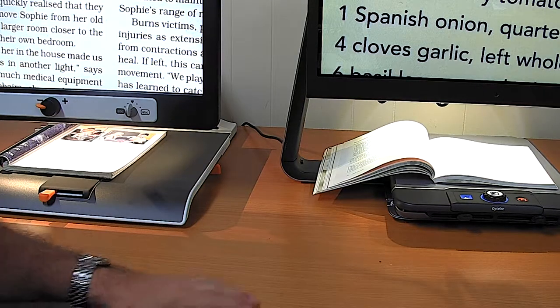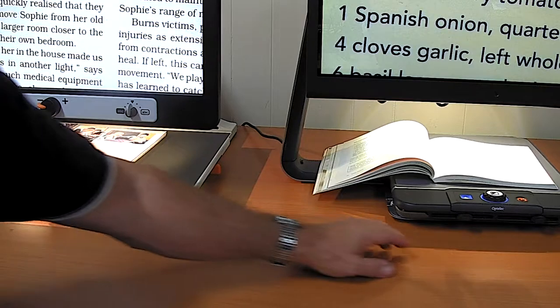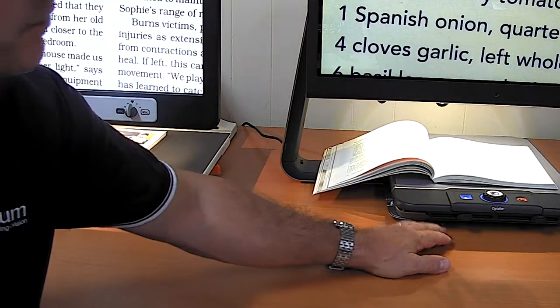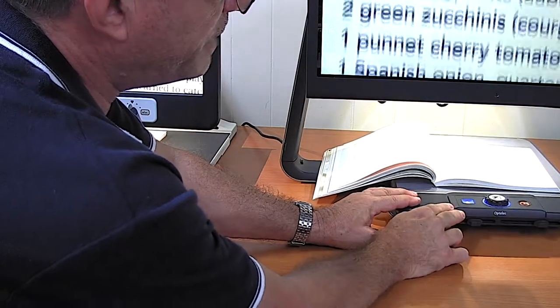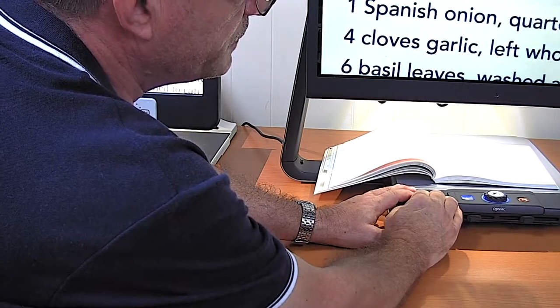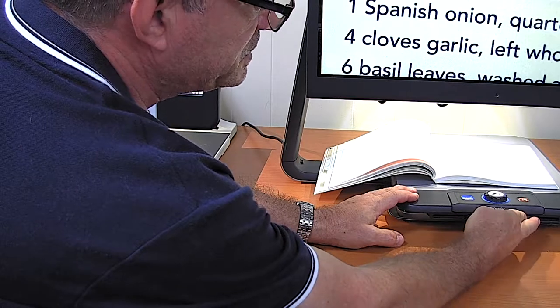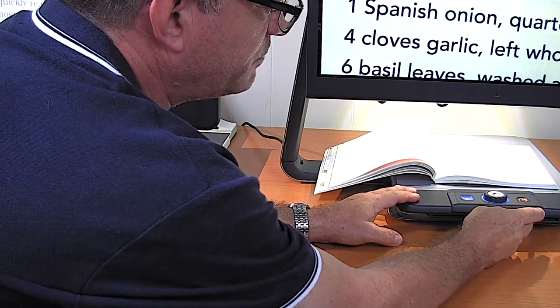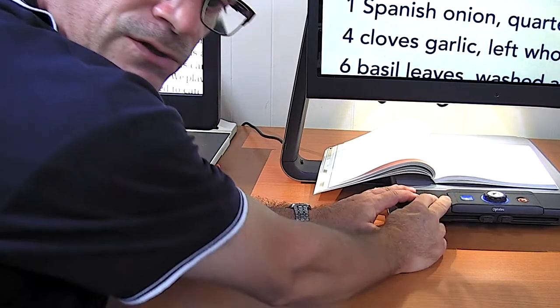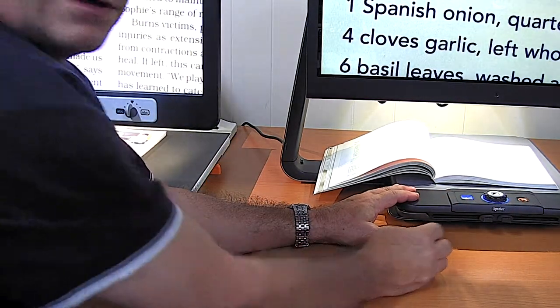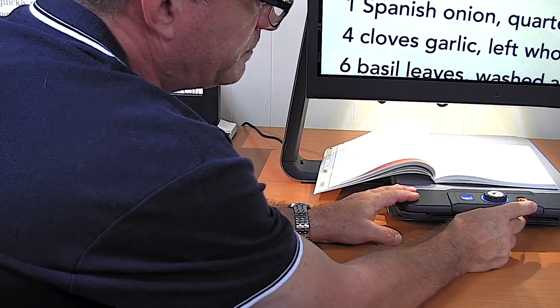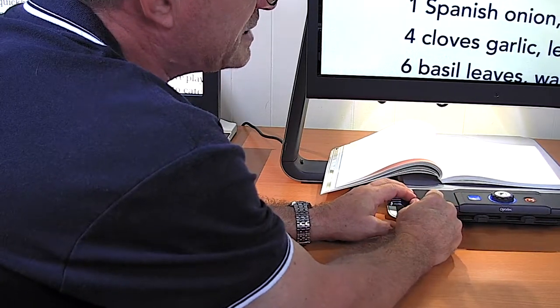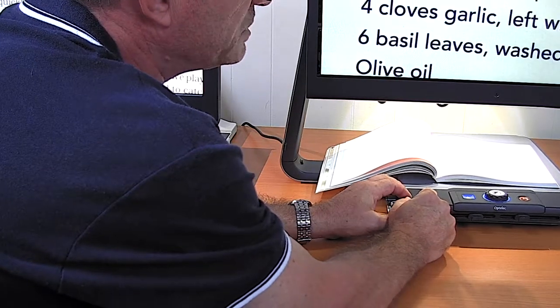All of these sliding trays have the capability of applying a little bit of friction to the motion, either in the back-forward direction or in the left-right direction. These clutches you see here are like tab stops on a typewriter. They can be pulled all the way in to lock the tray, or they can be released to a certain point so that there is some restriction on the motion backwards and forwards.